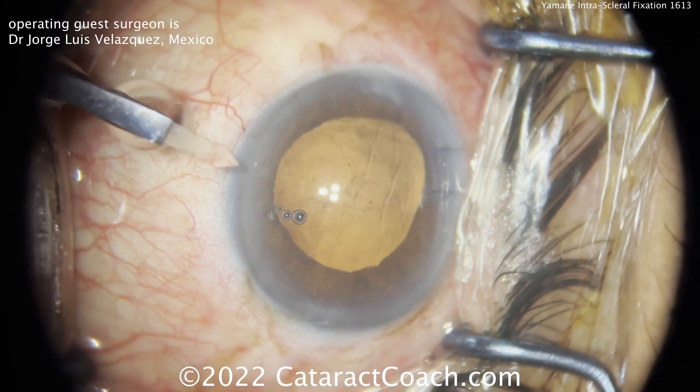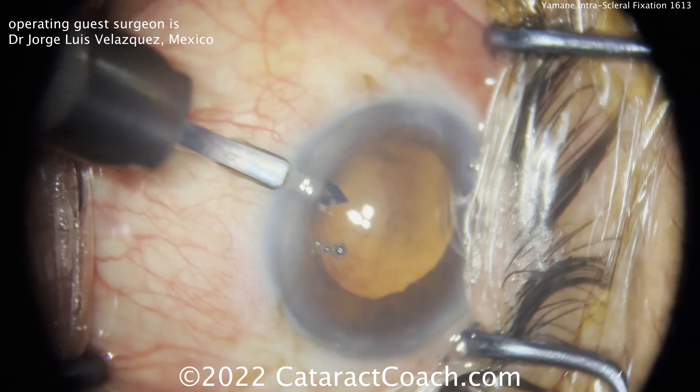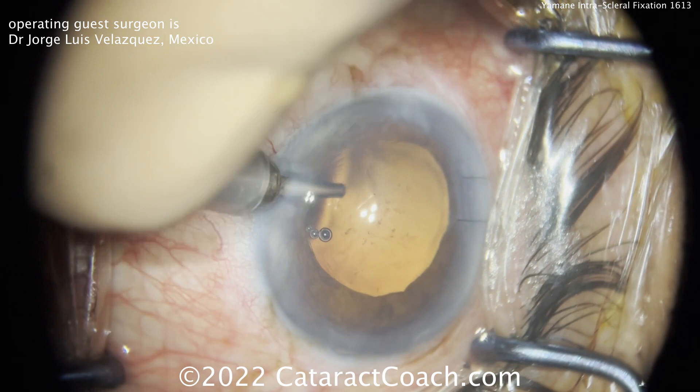The patient here is aphakic and there's no lens support at all — no capsular bag, no sulcus, no anterior rim, nothing. So the patient is going to need some sort of fixation.